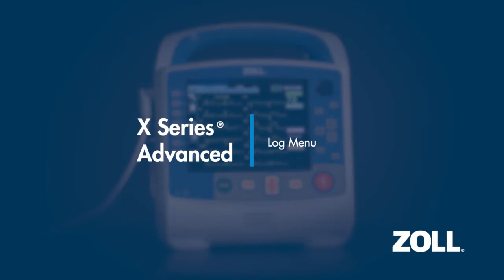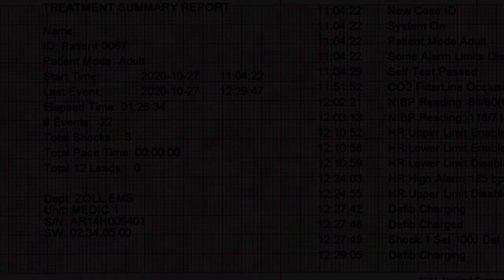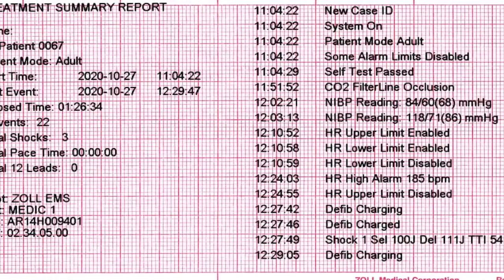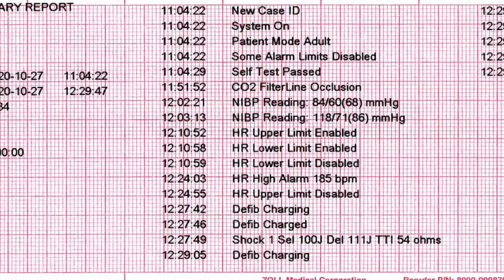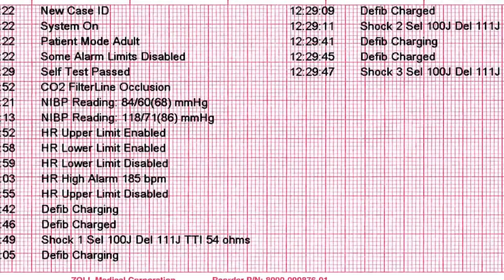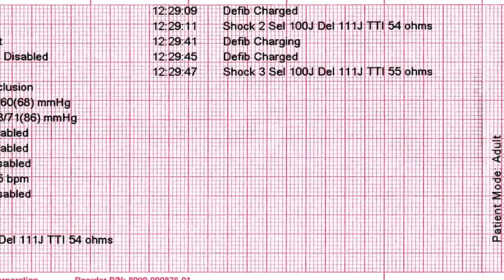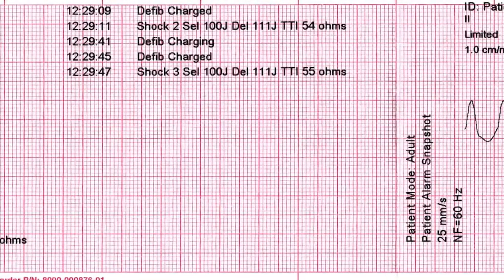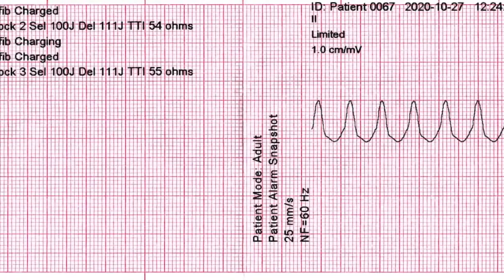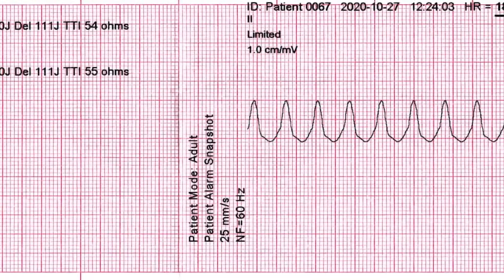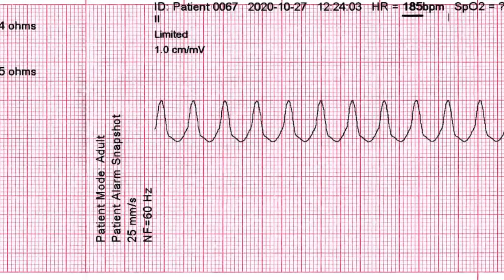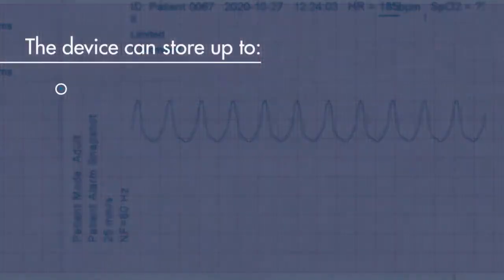The Log Menu provides access to the X-Series Advanced full disclosure case log, which continuously stores information during a case. The device can maintain up to 150 separate full disclosure cases that contain treatment events, trends, ECG and continuous waveforms, monitoring and event snapshots, and 12-lead snapshots and analysis. It can concurrently store up to the following events.